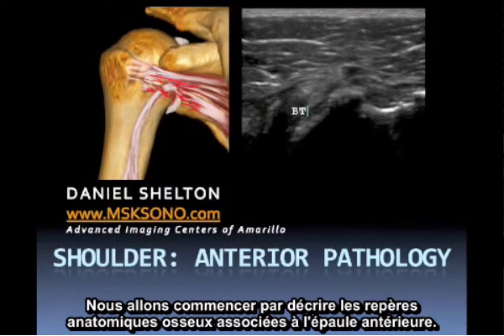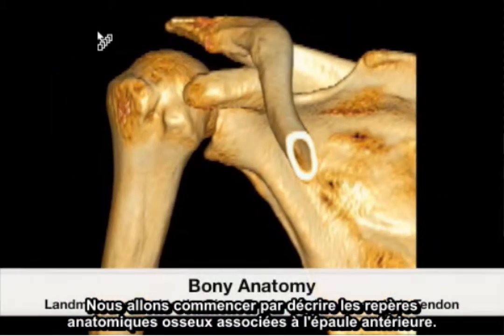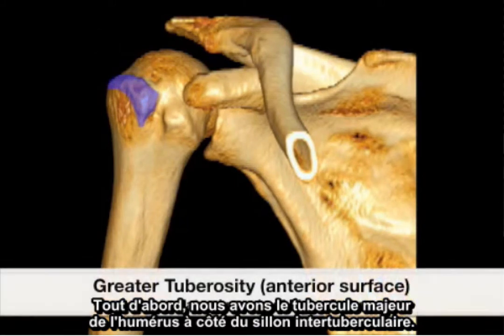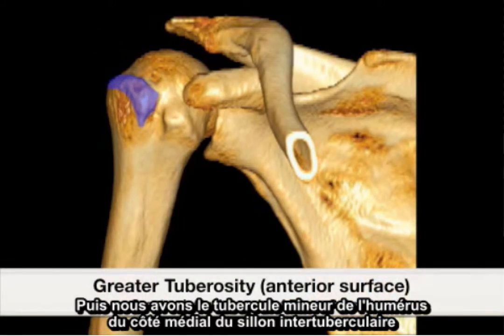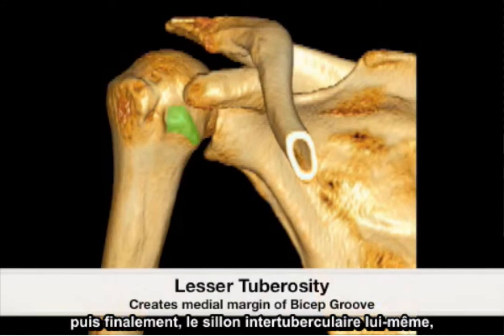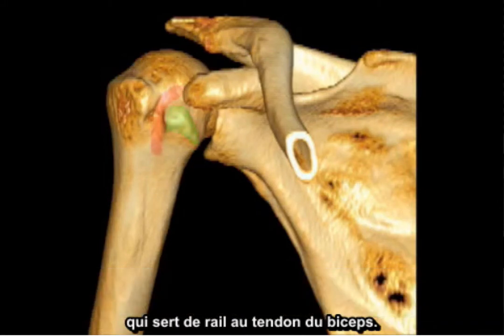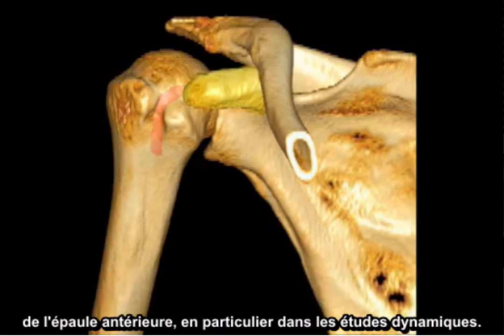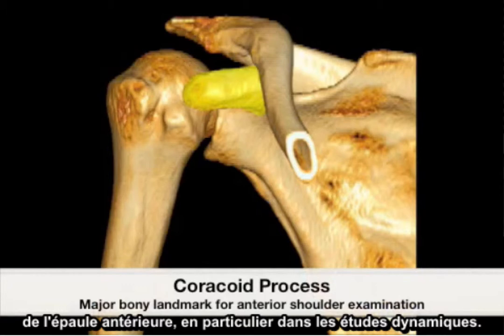We'll begin by describing the bony anatomical landmarks associated with the anterior shoulder. First, we have the greater tuberosity located lateral to the bicipital groove. Next, we have the lesser tuberosity located medial to the bicipital groove. And finally, we have the bicipital groove itself, which is a tract for the bicep tendon. A major bony landmark associated with the anterior shoulder, especially in dynamic studies, is the coracoid process.